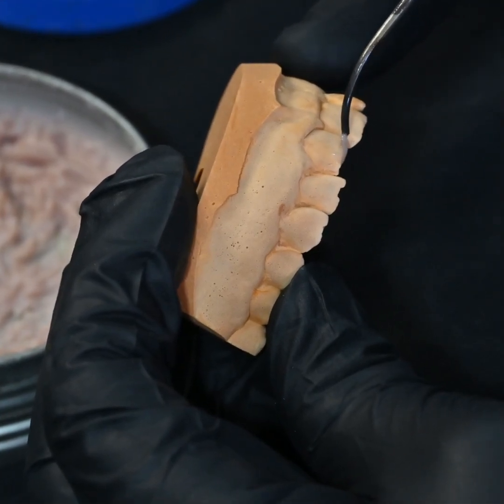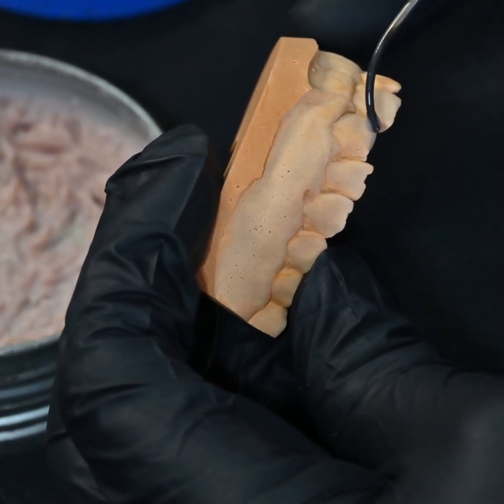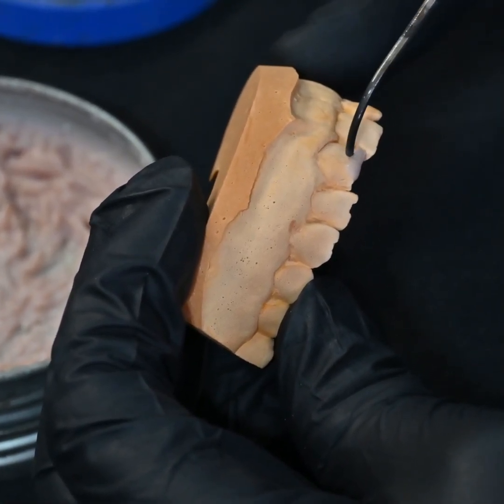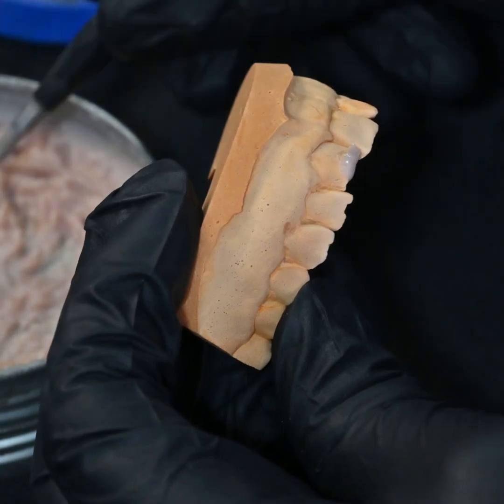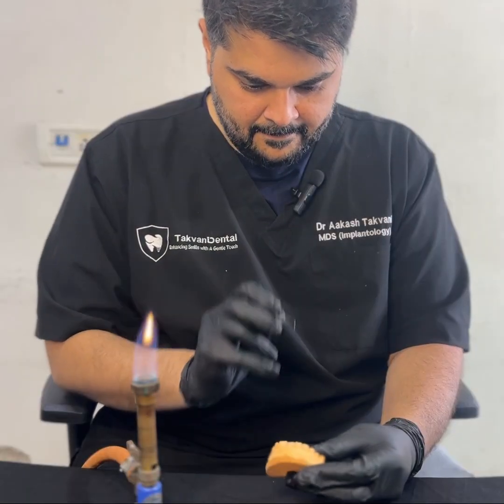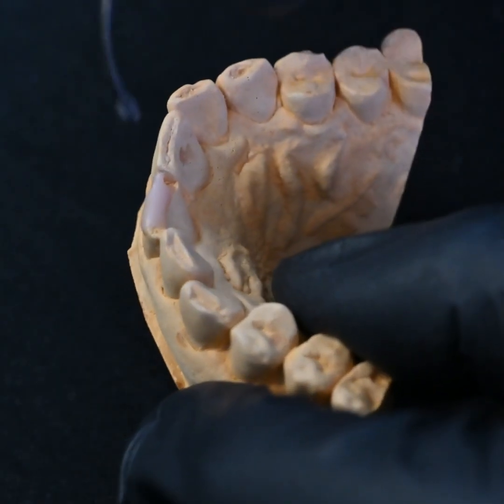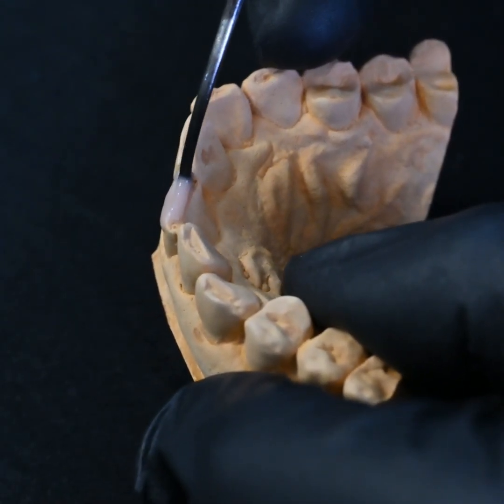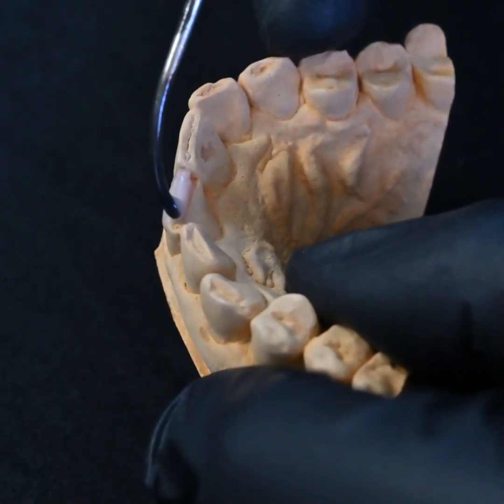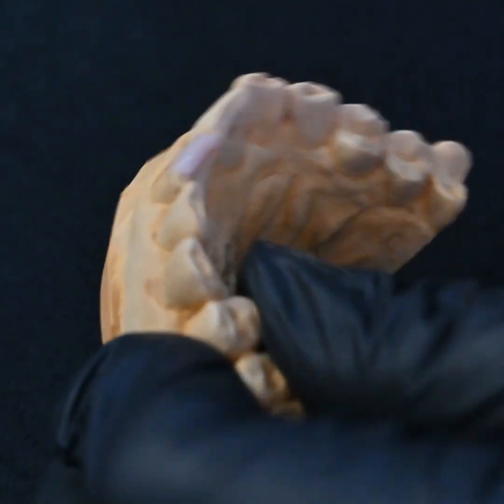Drop the dropper end, dip it in the wax, take the wax and carry it on the cast. We just keep adding it like this, drop by drop. The process continues the same way on the labial as well as the palatal aspect. Just keep adding wax wherever you feel it's deficient.